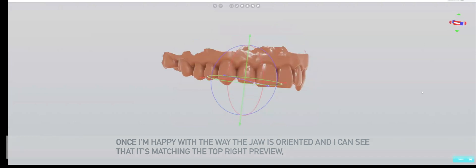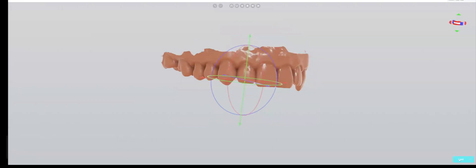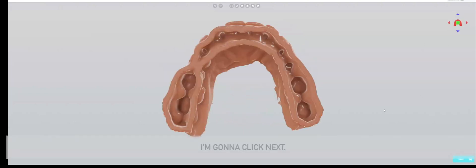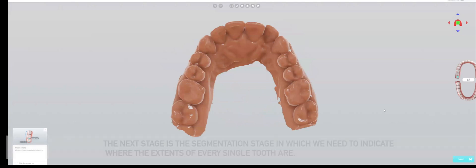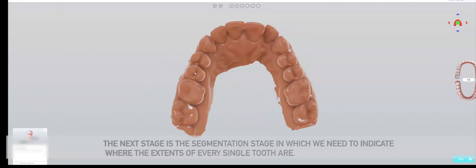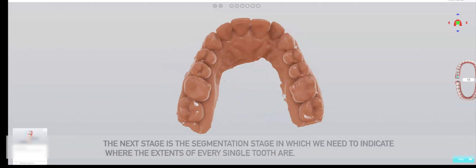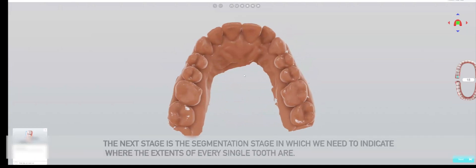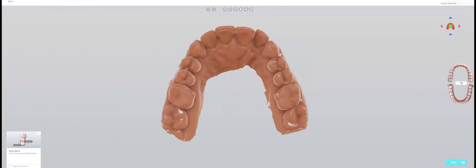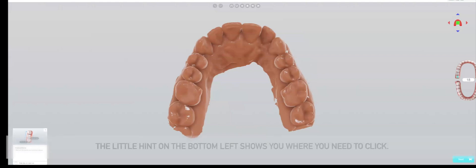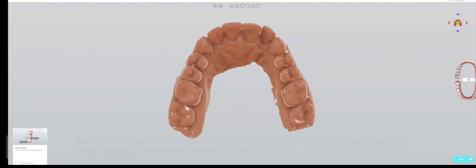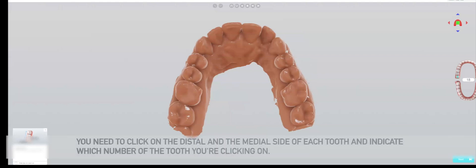Once I'm happy with the way the jaw is oriented and I can see that it's matching the top right preview, I'll click next. The next stage is the segmentation stage in which we need to indicate where the extents of every single tooth are.